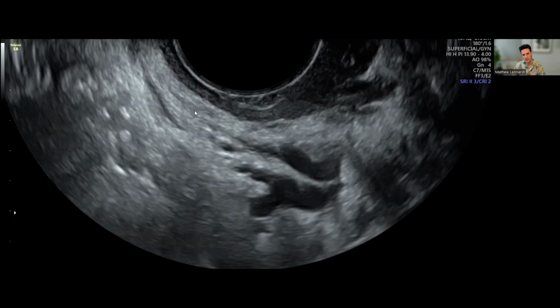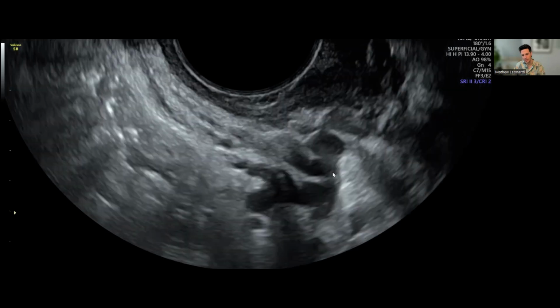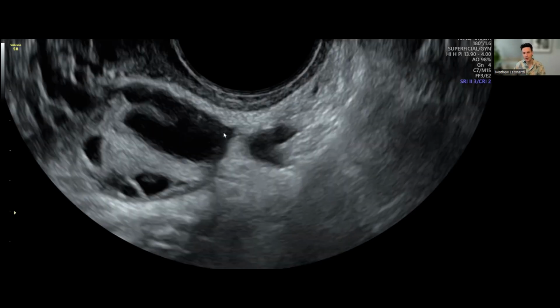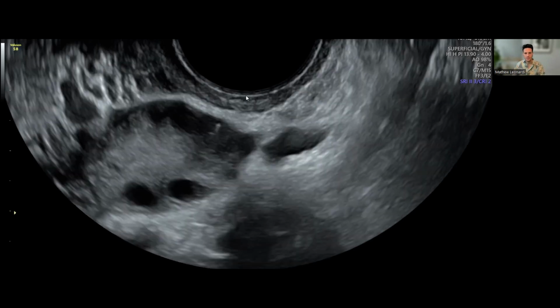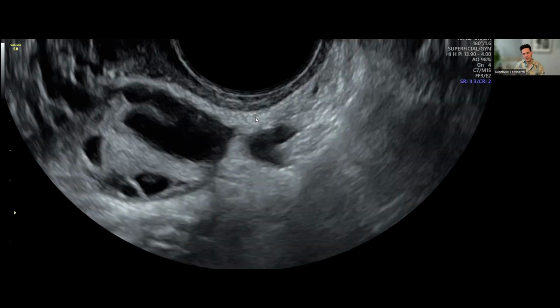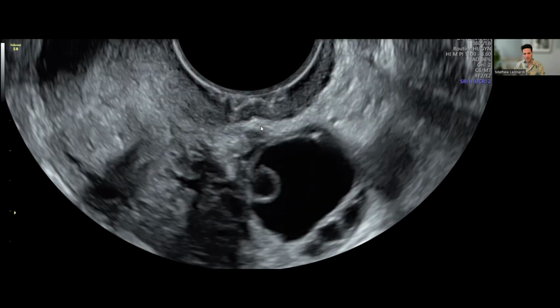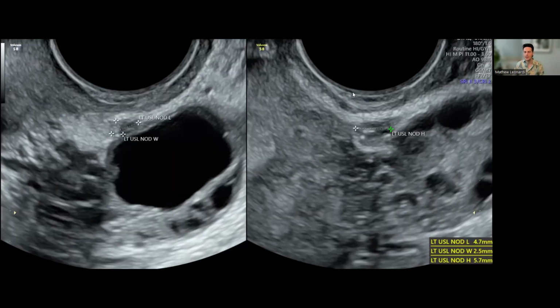And here we have the other side coming there. And this is where it'll cross. It'll turn around at that point. This is the uterine artery here, and this will be where it crosses and comes down the pelvic sidewall. There's another picture of it there, but not overly concerned about the ureters in this case. So I think this is the end of the scan. I will just come back to this particular picture as I tidy up the final message here.